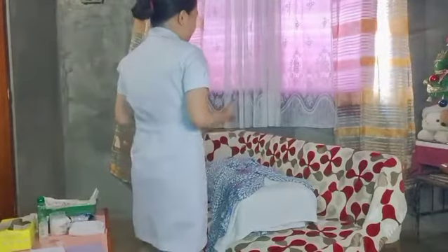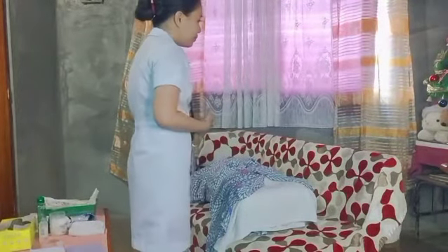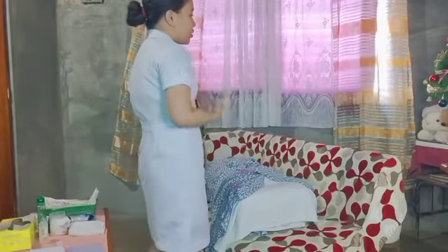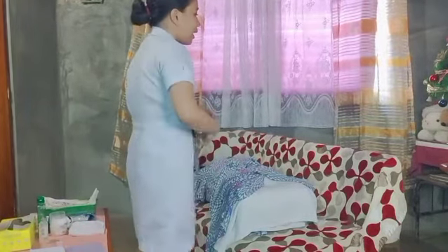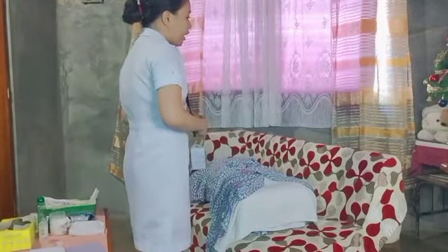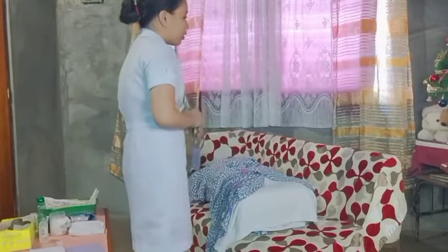Good day, ma'am. I'm Kyla Bruno. And what is your name? Okay, ma'am. I'm your student nurse, and we are going to insert and remove afterwards the catheter. And also, we will get your urine sample for the whole procedure. Is that okay to you, ma'am?